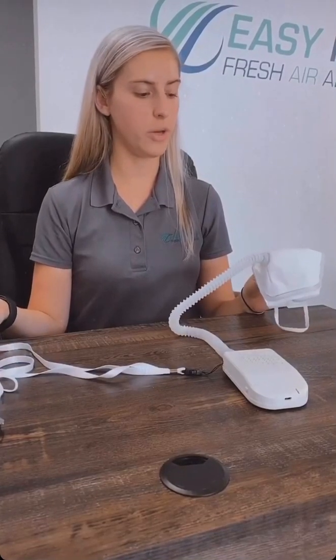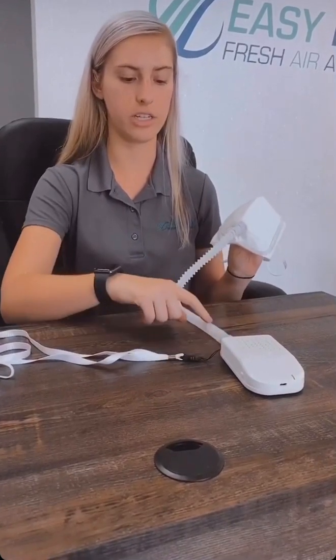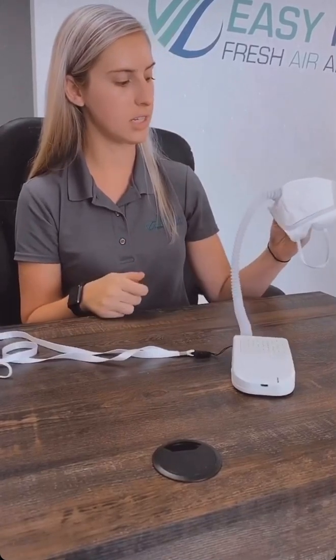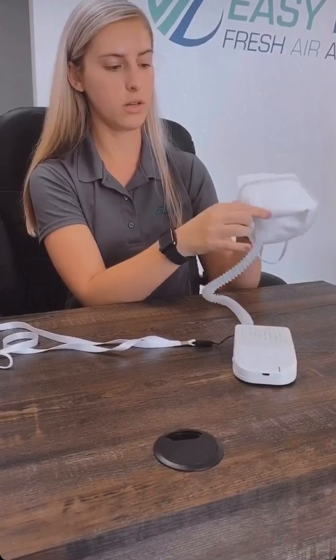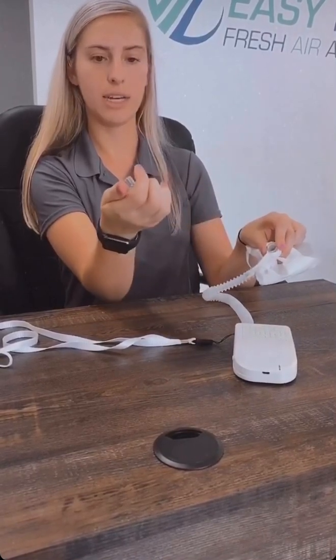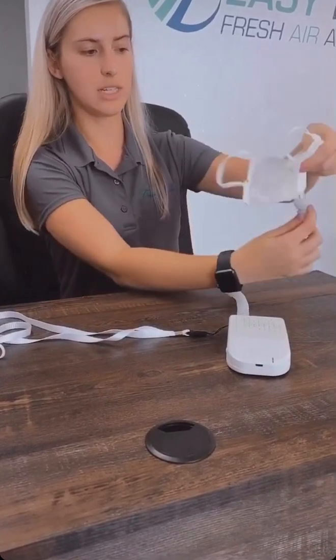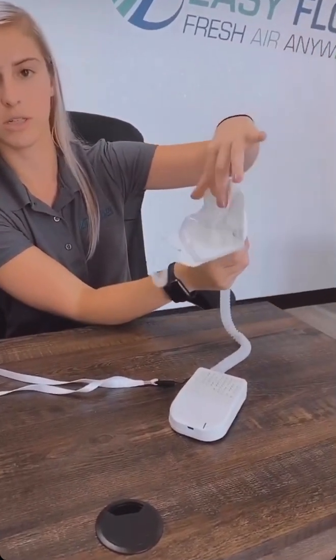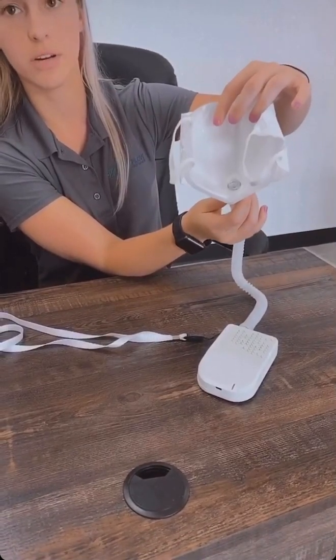Now we're going to show you how to cut a hole into your mask. This is the second option on how to connect our EasyFlow device to your mask. And this is the end result, where you've created a hole, you're able to put in the hose, and then you take the plastic connector piece, and it creates a really tight seal. And as you can see, when I pulled this hose, even though I've cut a hole, it's not compromising the mask. It creates a very tight seal.